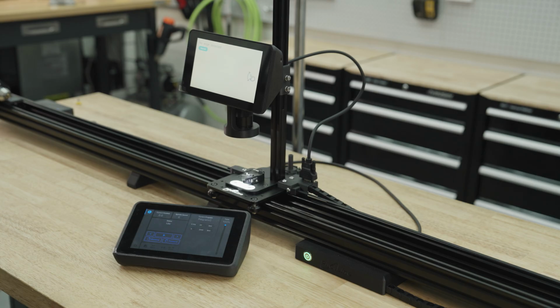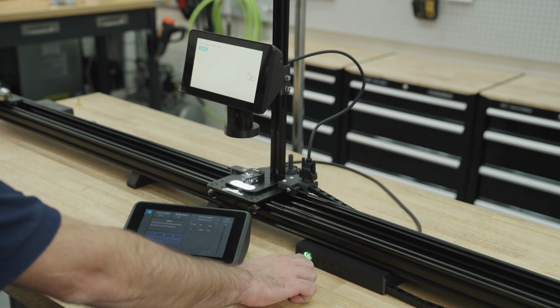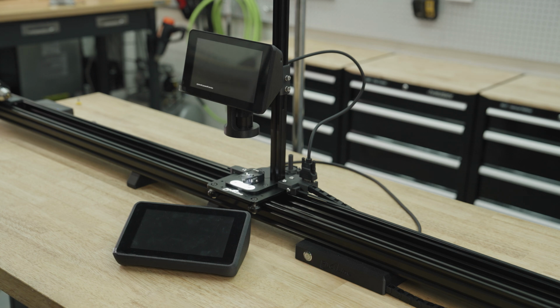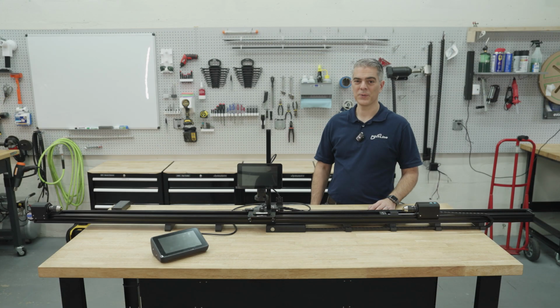To power down the machine, just press and hold the power button. Once the screens turn off, you can walk away. And that's how you use your coil winder.